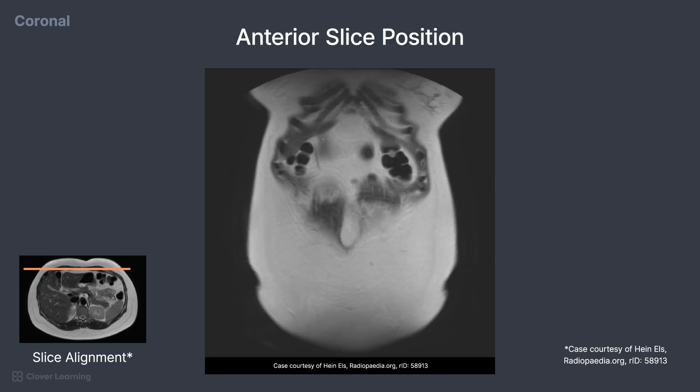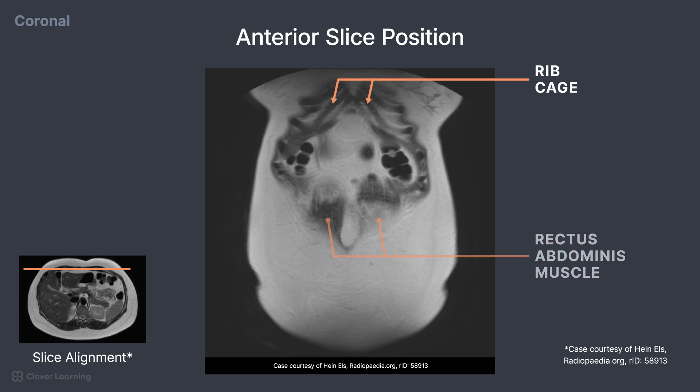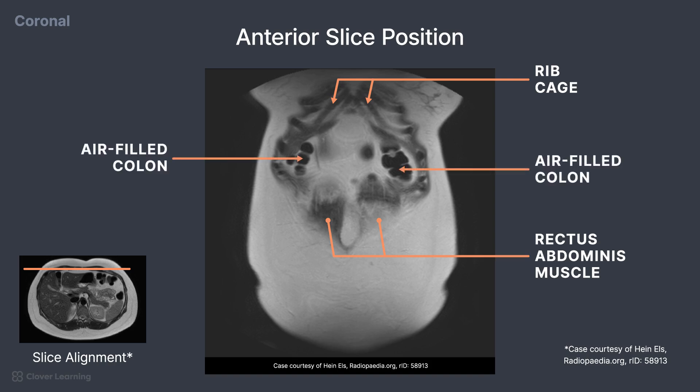we can again see portions of the ribs. Towards the center of the image, the rectus abdominis muscle is demonstrated just underneath the subcutaneous fat. On the corners of the rib cage, the dark circular areas are portions of the air-filled colon.